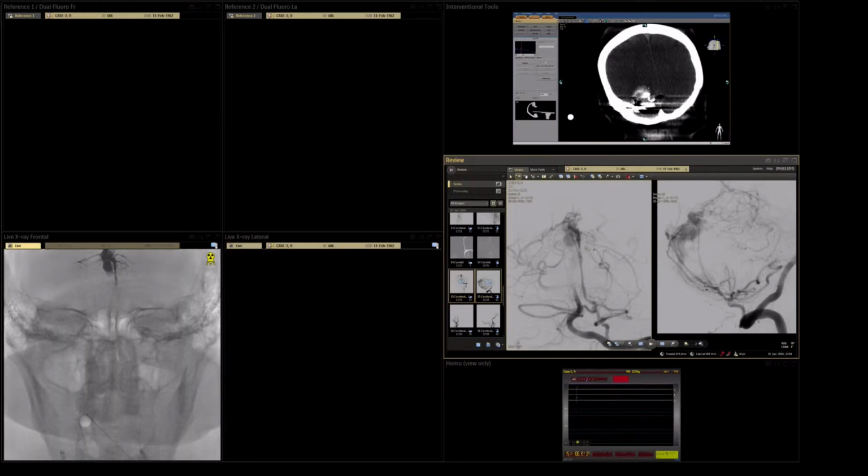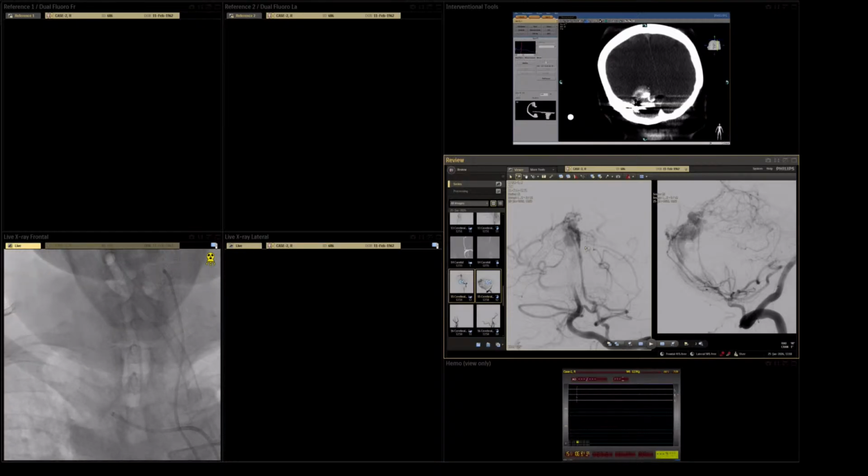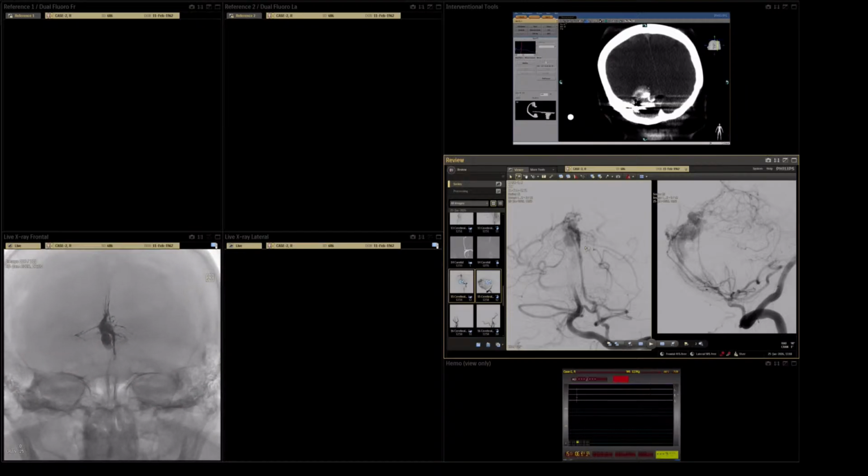Okay, now I will bring my Neuromax back. And we can do angio from here.